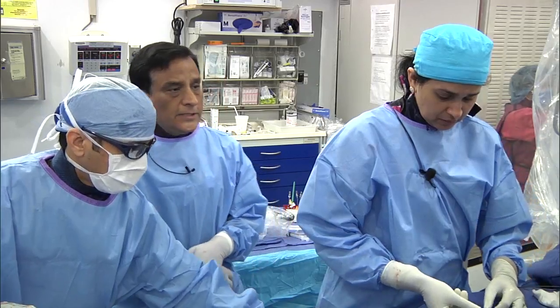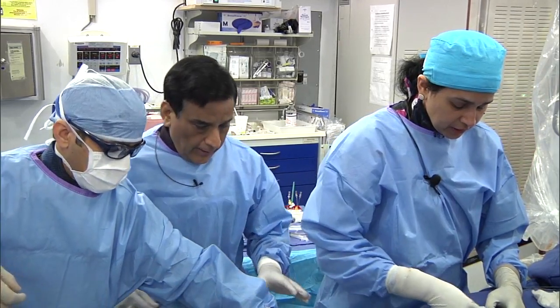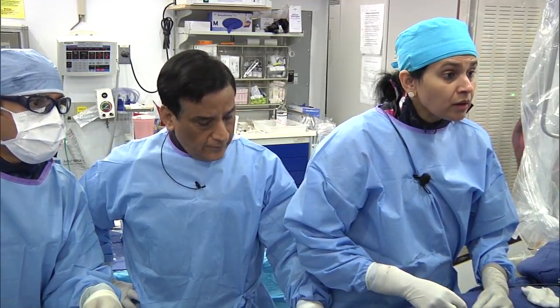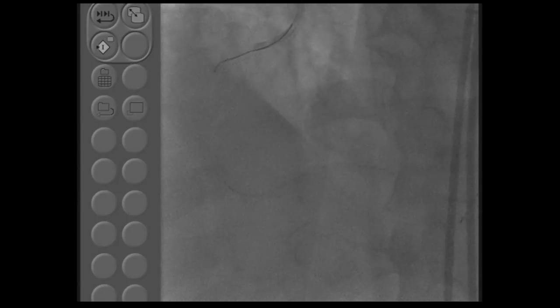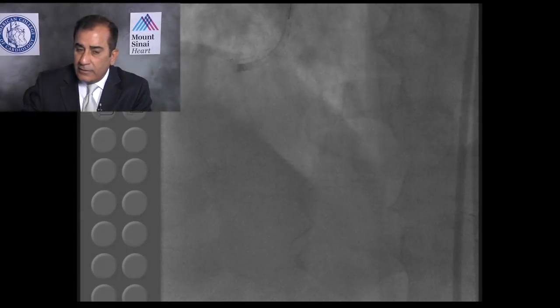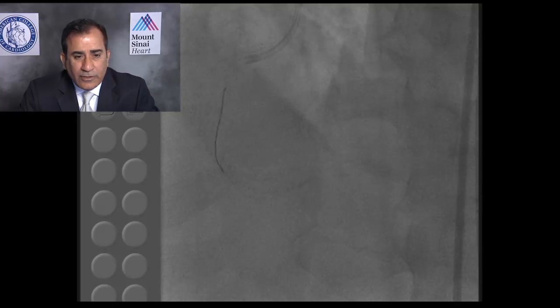With that note, you can just sum it up now, or do you want to put a balloon or stent? What is it now? We are putting another stent. Okay, so let's put this third stent, and now your wire is a different wire. So after the third, we'll ask for one comment, and then we are done for this complex case, and still able to do it in a timely fashion with just maybe a few minutes extra. So this really becomes our first live webcast of the modified CTO technique.